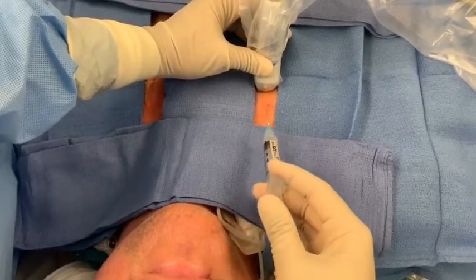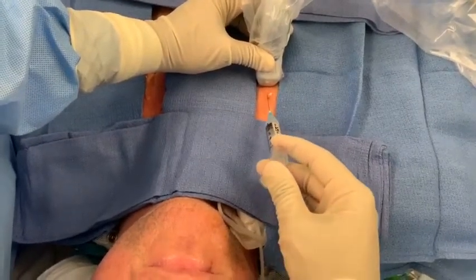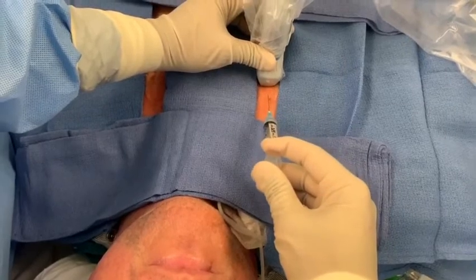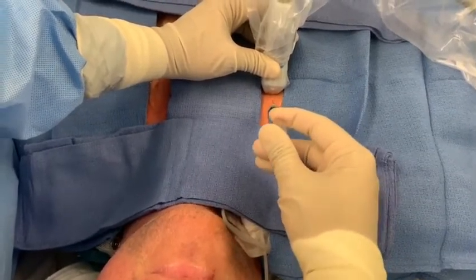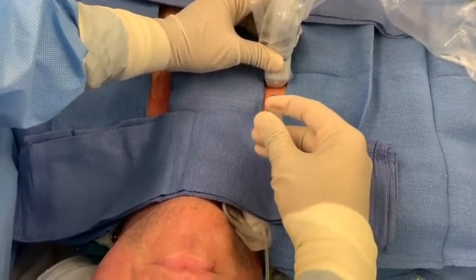This is a demonstration of a pecto-intercostal fascial block performed for refractory pain following sternotomy, which limited respiratory function.